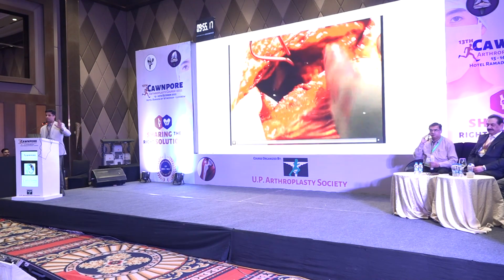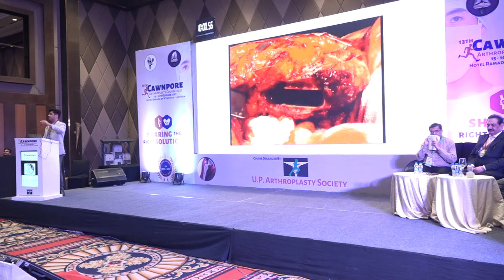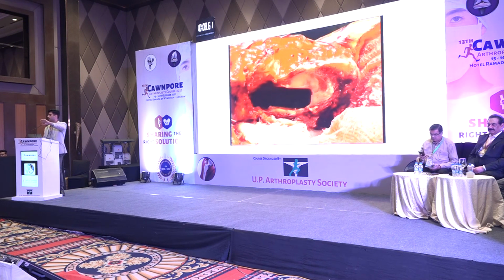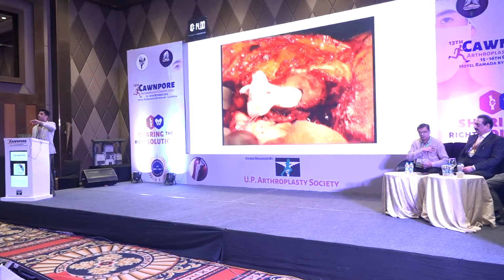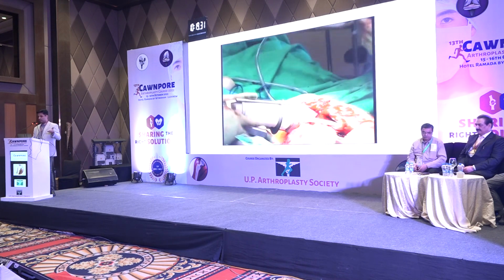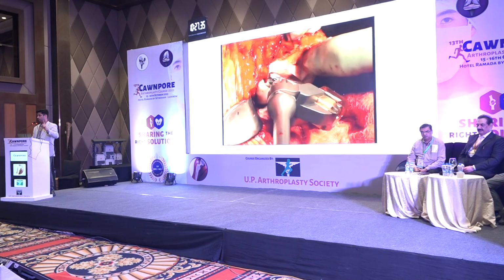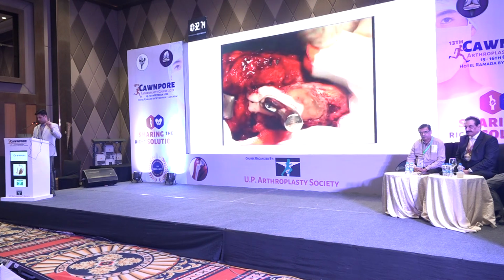Trial reduction, because you want to know up to where this definitive stem that you're going to put in now, the smaller size stem, is going to sit. Otherwise, what will happen is you will end up pushing it distal inside a bit more. Now you can use small burrs and you can sort of remove that cement, or you can use an ultrasound device and you can just dissolve some of the cement around it, so you have new space for the next batch of cement, which again you can use a cement gun and you can push it inside and then put in your prosthesis after packing that cement, pressurizing the cement up to the level you've decided. So this is important. That's why you got to do the trialing here before you start preparing the canal.